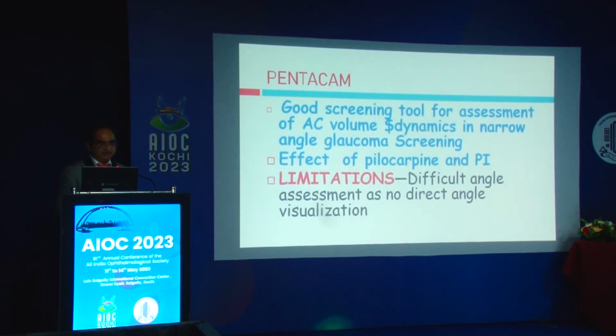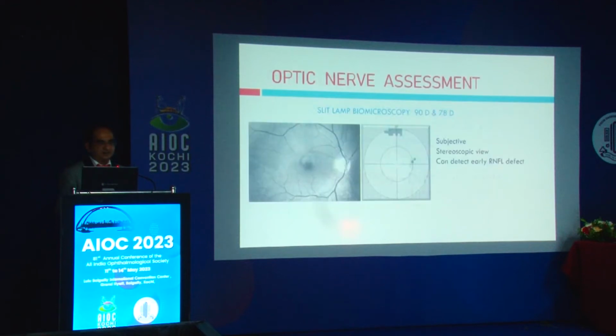Next one is the Pentacam, which is the only good screening tool for anterior chamber volume and dynamics. The limitation is difficult angle assessment, as there is no direct angle visualization.